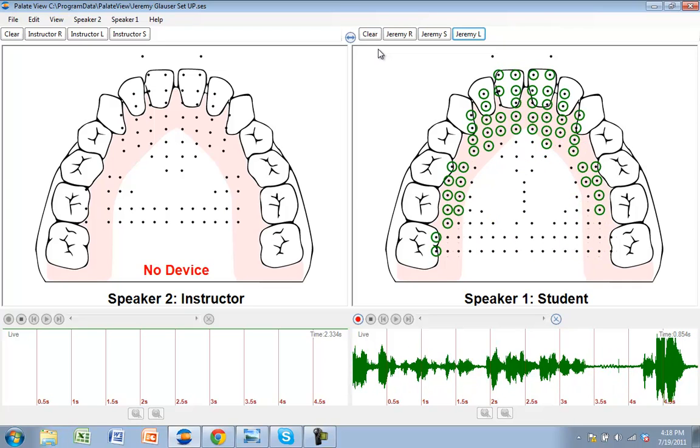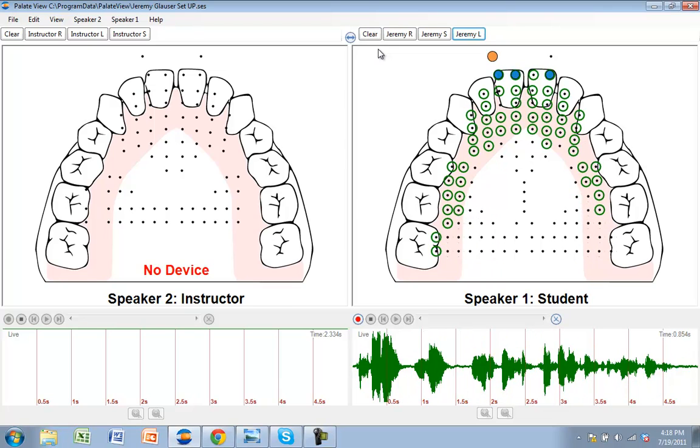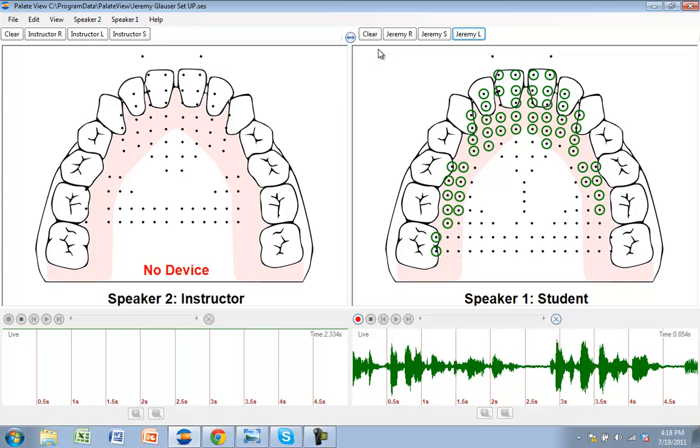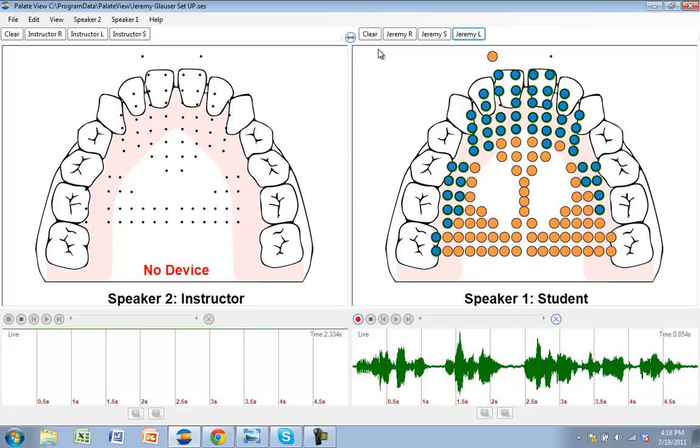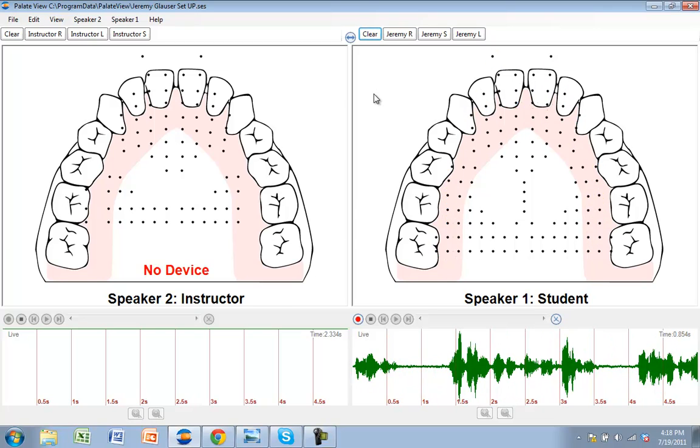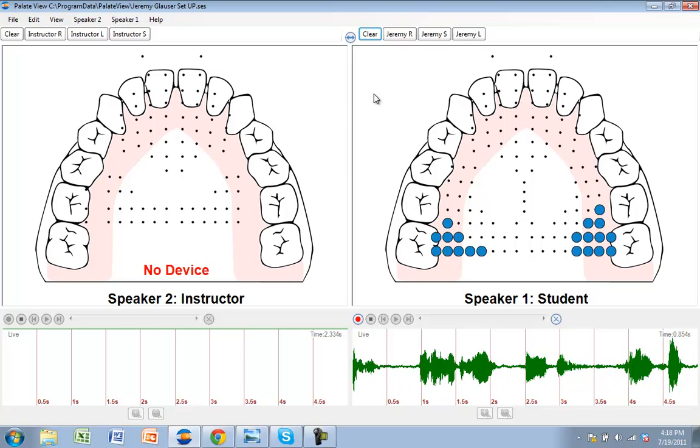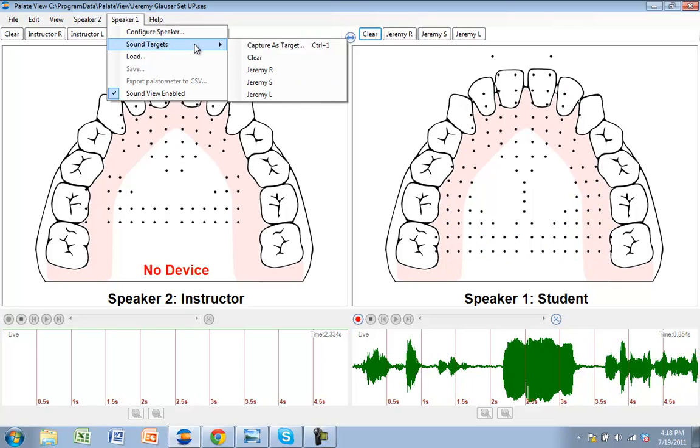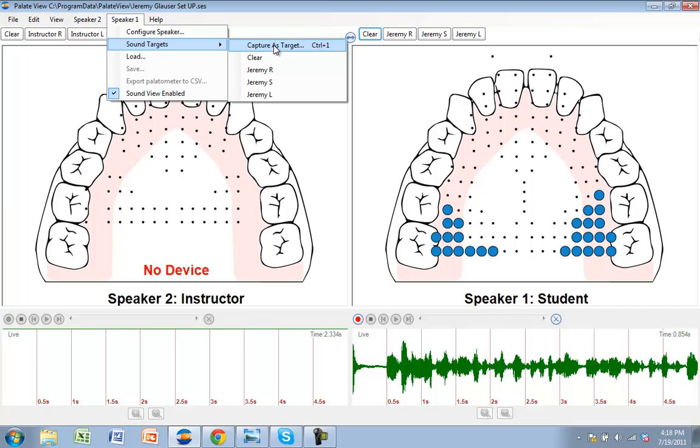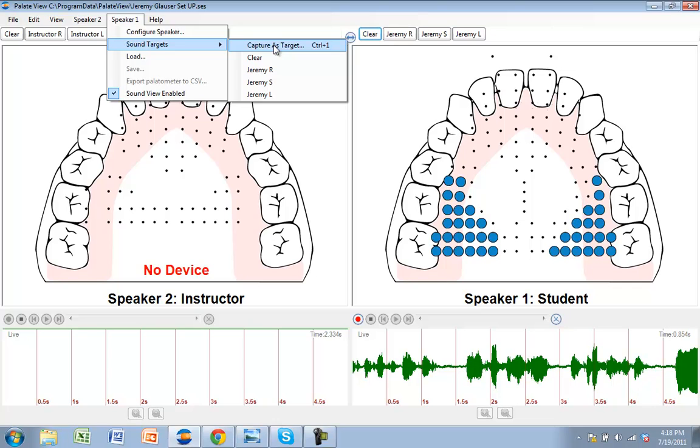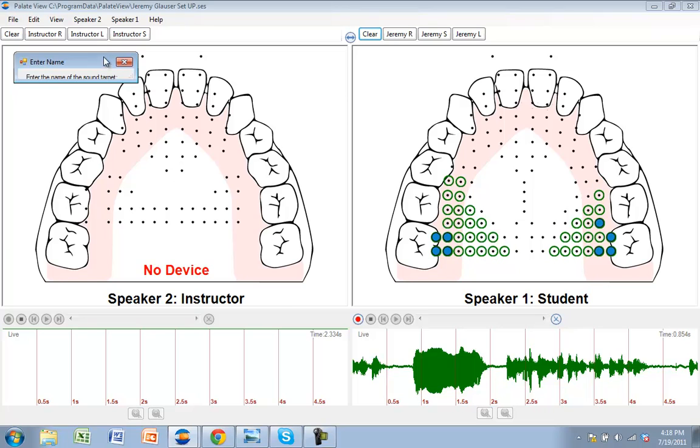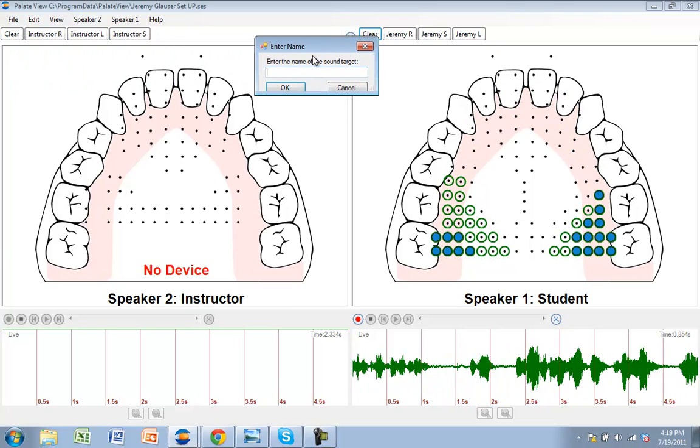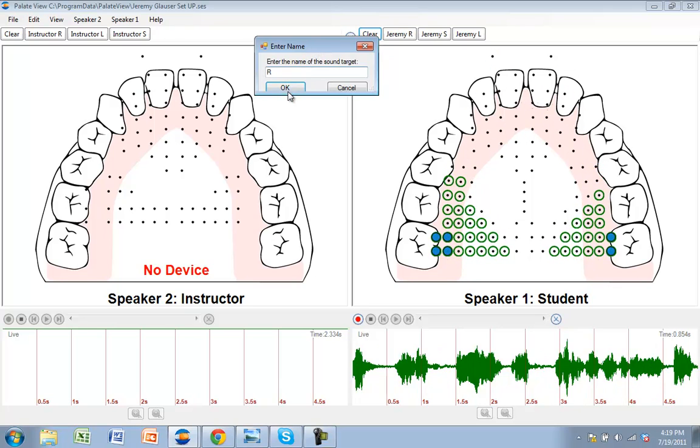To start off, you have more than 36 pre-programmed targets that we supply to you, but because every student's sound production slightly varies, you have the ability to custom-make a sound target. Let's go ahead and try that. I'm going to clear this here, and I'm going to make the sound for the letter R, for example. And as I'm making that sound, I can come up here to speaker one, and then sound targets, and capture as target. I will capture my sound production on the screen. You see the green circles that have captured that sound. What you can do here is bring this little box and name that whatever you'd like. In this case, I'm going to name it R, and I'm going to press OK.